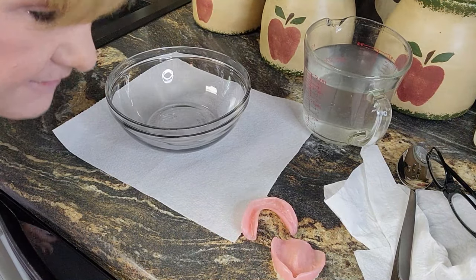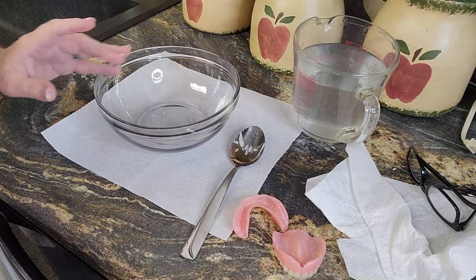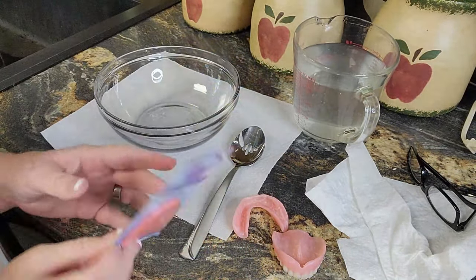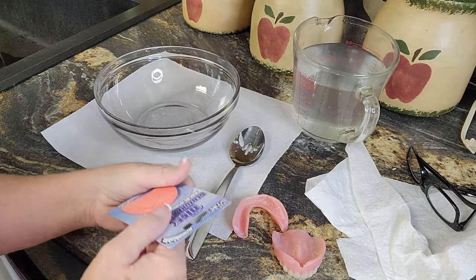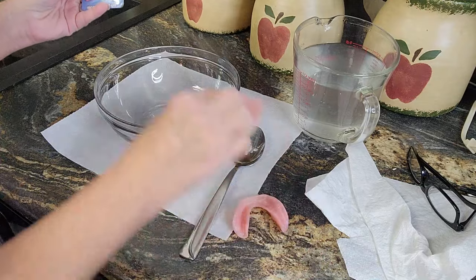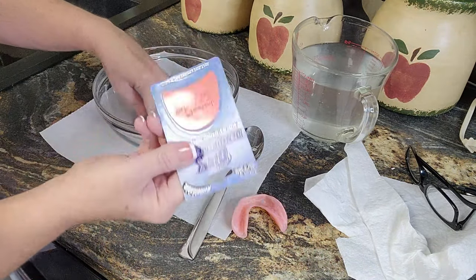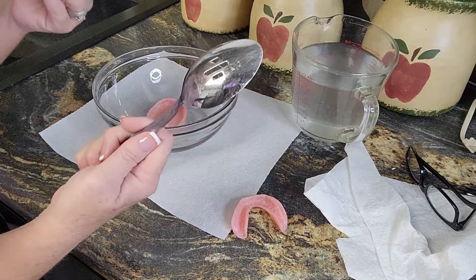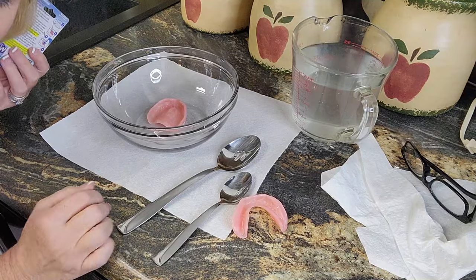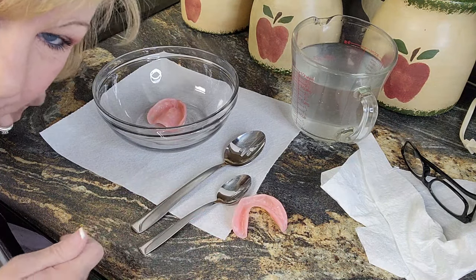Okay, I got all this stuff. You're supposed to have a metal utensil, got one. This thing, which I should open, says don't put this in direct sunlight because it'll melt, and it's also reusable. So yeah, let's test this out. So the denture goes in the bowl, this goes on the denture, and that hot water goes on the thing, and I'm supposed to hold it in place with the metal utensil and take it out with a metal utensil, and then form it. Let's just do this.